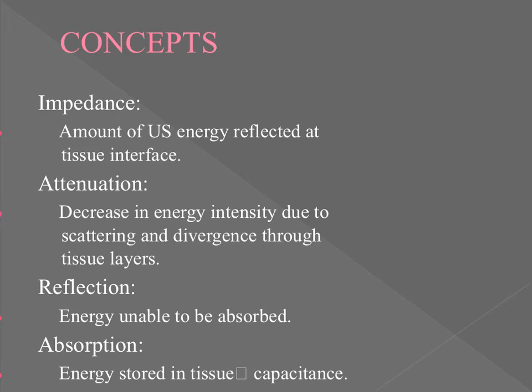of the treatment, right? Now, what we know about reflection is that it can be complete or it can be partial. So let me give you two examples of a complete reflection. One would be turning on the ultrasound machine and just allowing that ultrasound head to sit up in the air. Waves are going to bounce off of the ultrasound head and reflect back to the ultrasound head. That's probably in its simplest form, right?